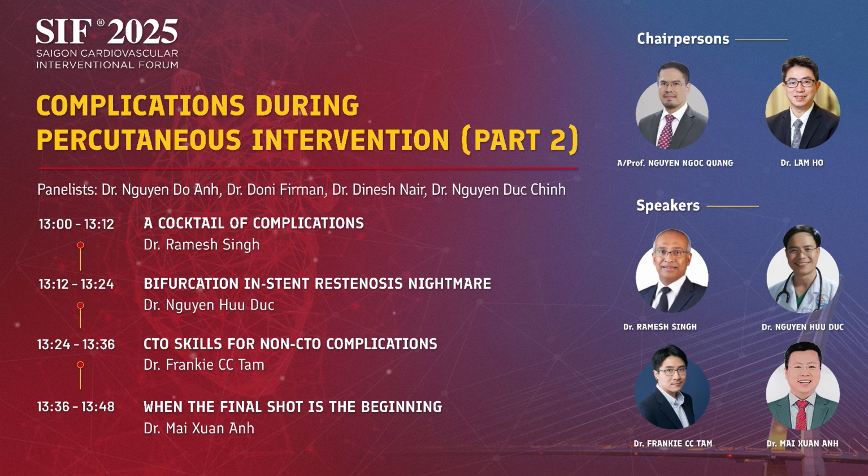Okay. Yeah, thank you. So I think it is a great case, and the main reason here is the wrong balloon size. So you cannot protect against that because it is like a human error, right? You cannot predict that.